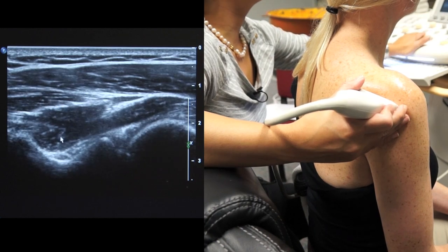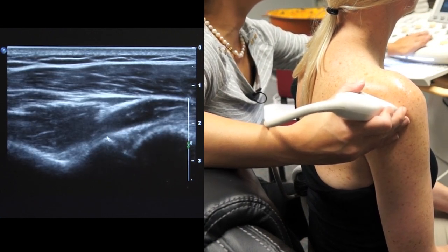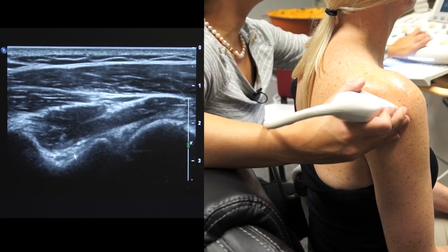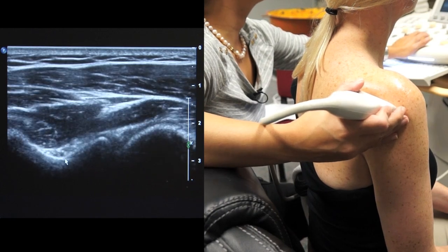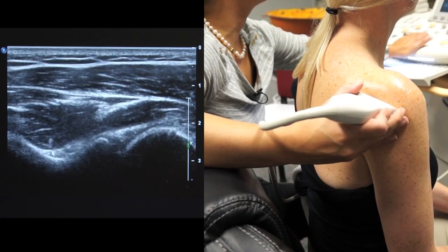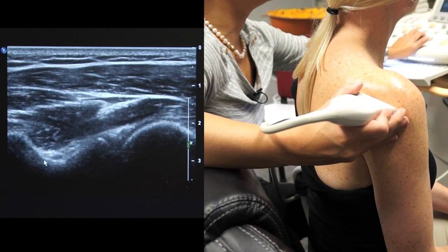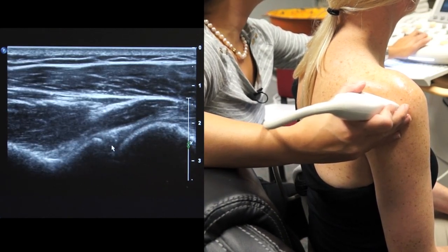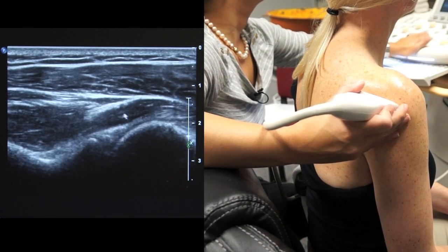Occasionally, you might see a cystic structure here, because if you have a labral tear or a paralabral cyst, or a ganglion, it can come and sit in this notch and press on the suprascapular nerve. And if you look closely, you might see that honeycomb appearance that you expect to see when you're looking at a nerve. And when you're looking for a joint effusion, you will see a joint effusion in this location, posteriorly.